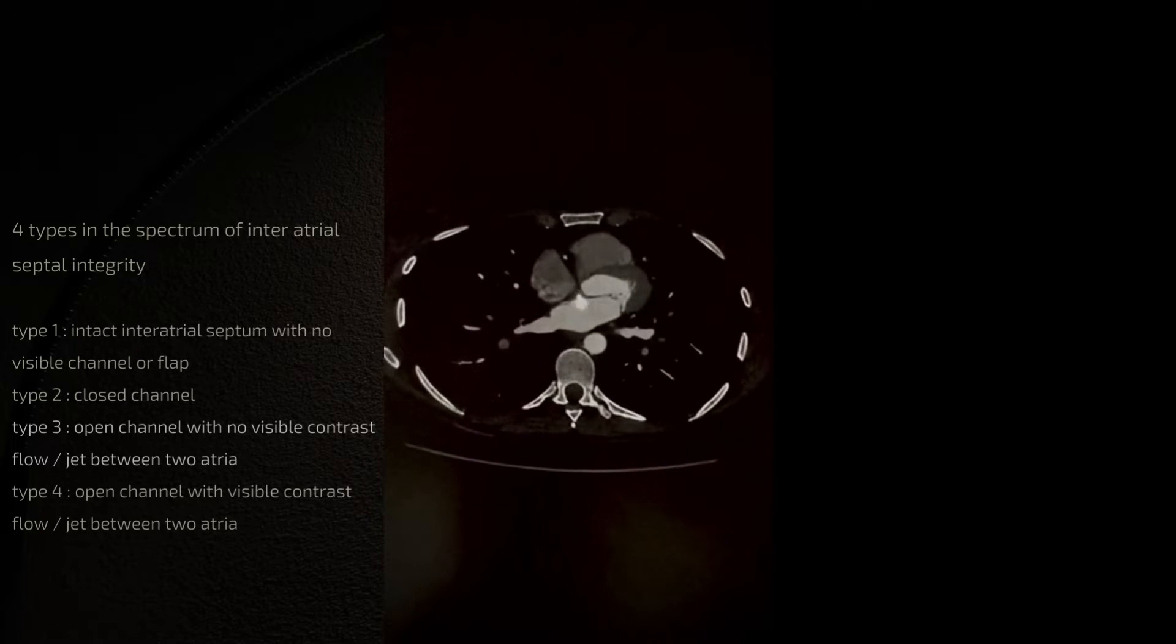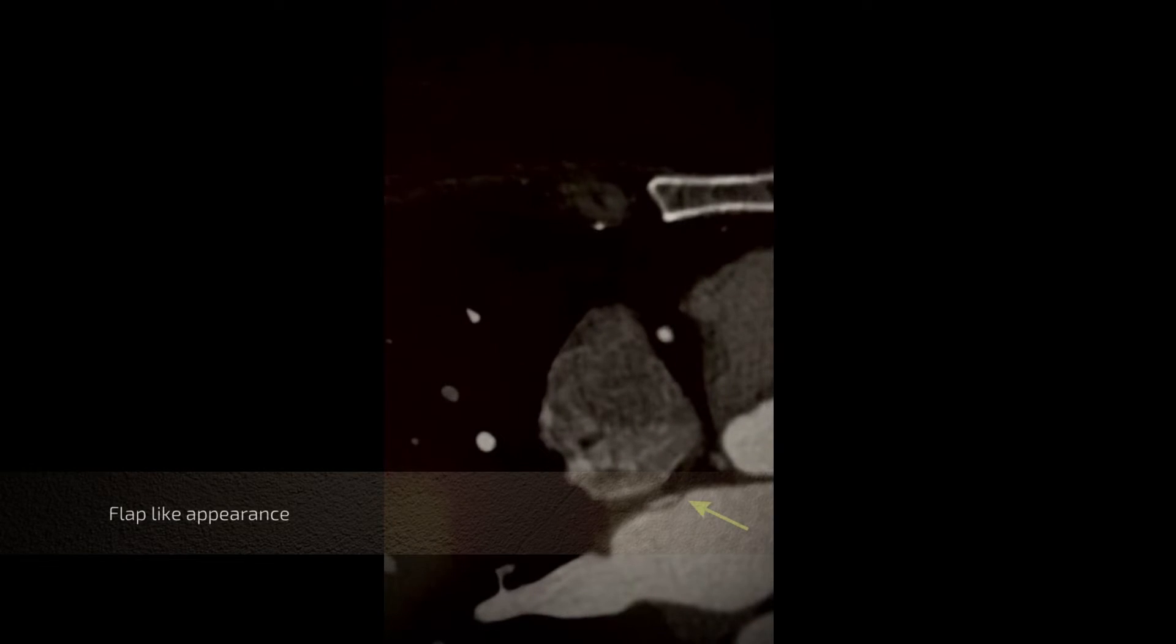Your attention is drawn to this area here which is the inter-atrial septum. If you appreciate this further we're going to zoom the image significantly and you would appreciate there's a small flap-like appearance to the inter-atrial septum. You can see here that there is a gap on this side and it extends through a flap and communicates with the opposite chamber which is the right atrium.